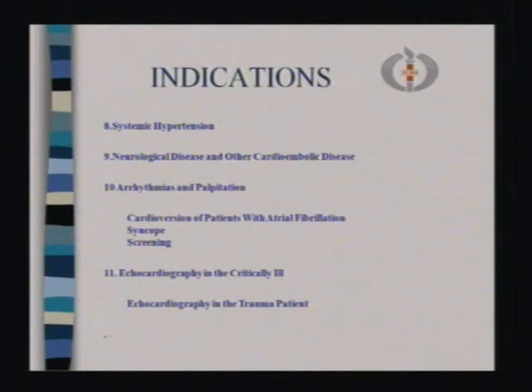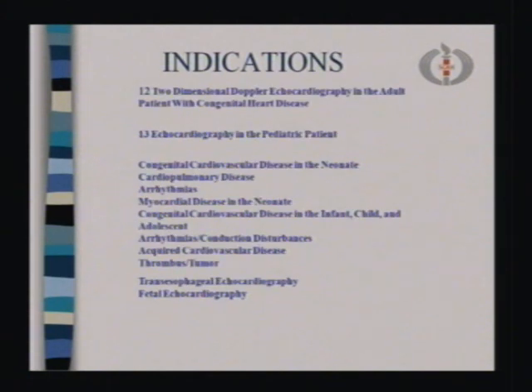Patients of syncope, you have to find the cause, any cardiac cause of syncope, those patients come to you for echo. And then screening, and even for patients who are screening for insurance purposes, patients who are going for surgery, those patients have to be cleared for surgery. For cardiac fitness, they come to you for echo. And echocardiography in the critically ill, which I will be discussing on portable echoes, and echocardiography in the trauma patient.